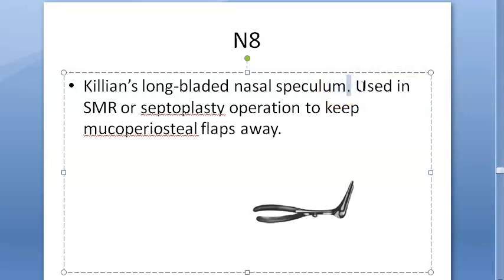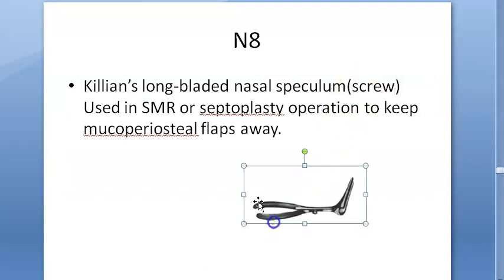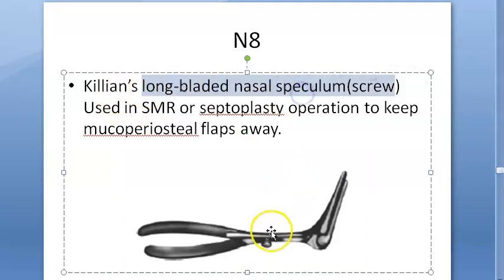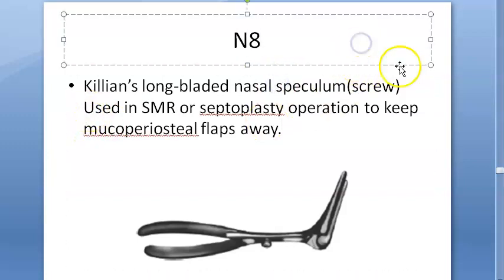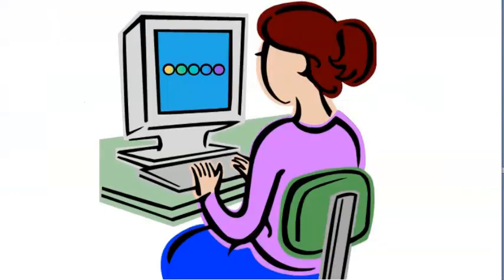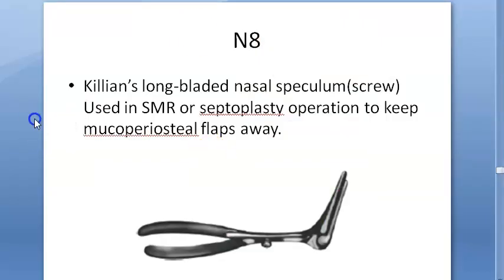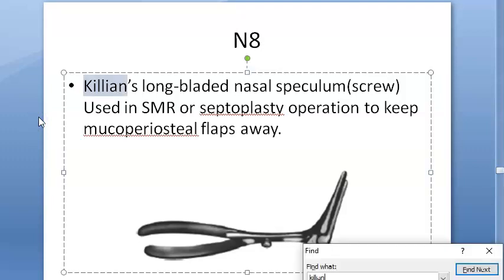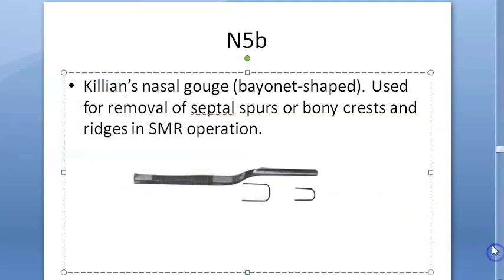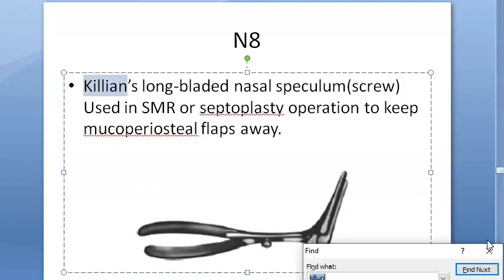Then Killian's long-bladed nasal speculum. See, it has a screw, so it is self-retaining — unlike the Thudicum nasal speculum. Because it has a screw it can retain itself, so you can use it in surgery to keep the mucoperiosteal flaps away. There are only two Killian's instruments: the nasal gouge and the Killian's long-bladed nasal speculum.